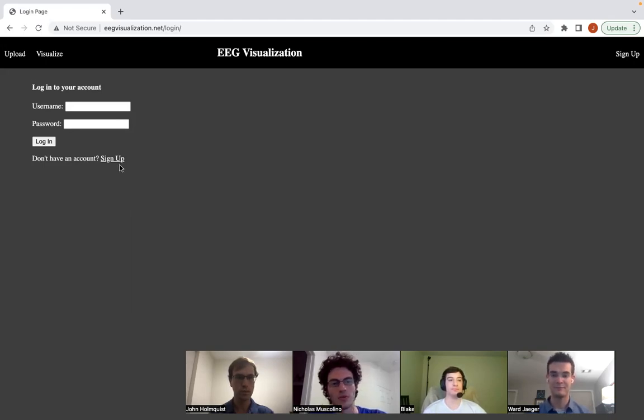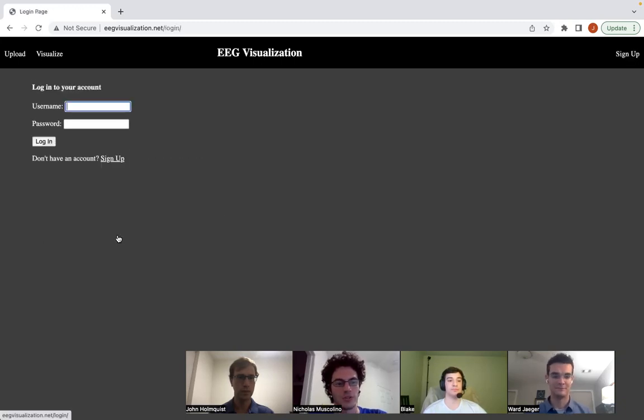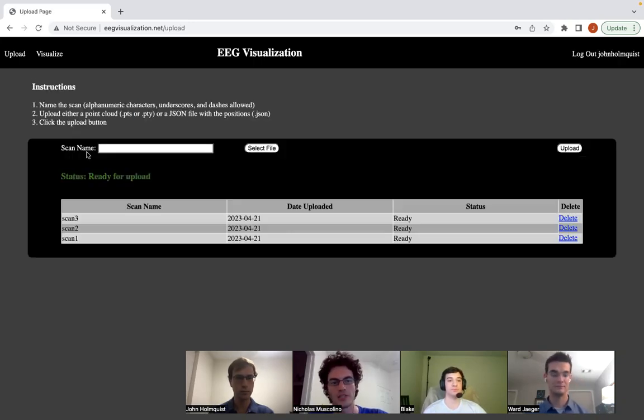So before you can use the website, you'll need to make an account, or if you already have one, you can jump over to the login page and just log in as normal. All the information pertaining to users is stored on the back end in a database we've created using SQLite. SQLite is something very common and easy to use with Django, which is our backend web framework.